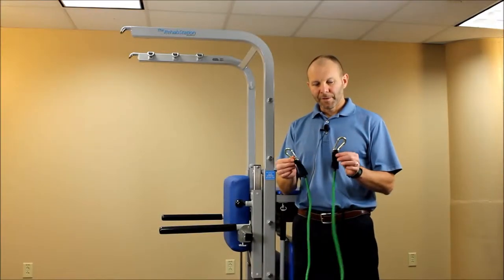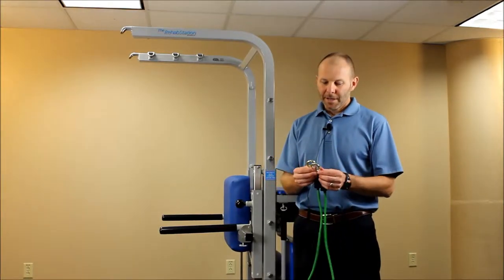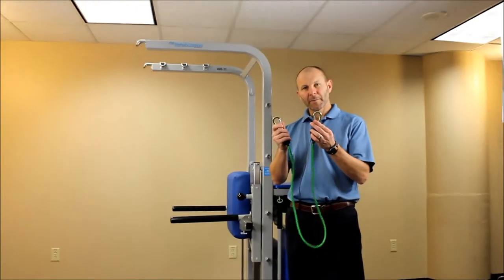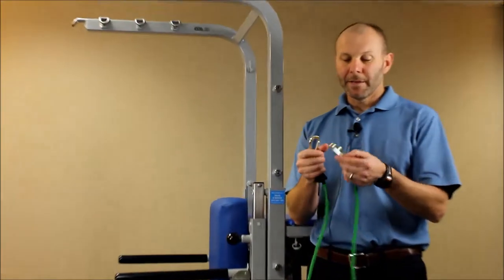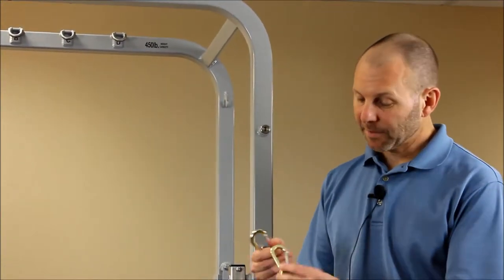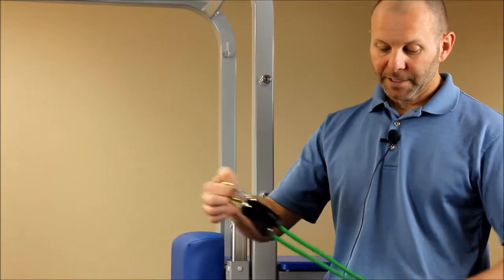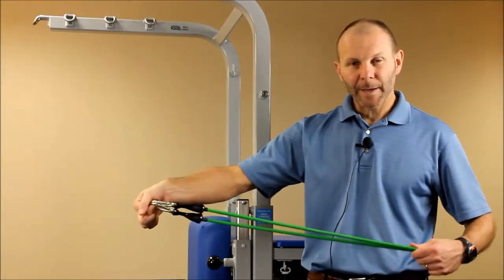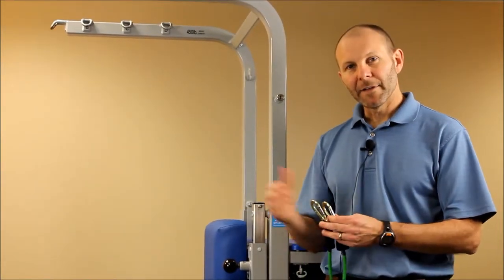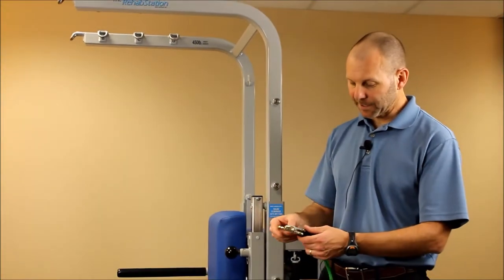I want to talk about an important feature of the rehab station, which is the elastic cords that come with each station. The elastic cords have two clips or carabiners on each end, and these are stamped with an approximate value of the resistance they provide. The green is a five pound resistance level. If you were to double this up, that would be approximately ten pounds, or if you combine it with any other resistance tubing, you would just add those together to give you an approximate amount of resistance.